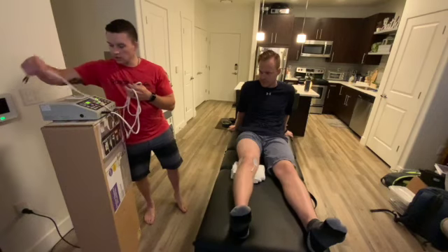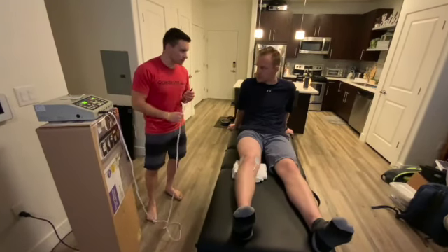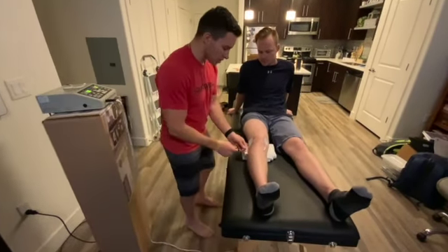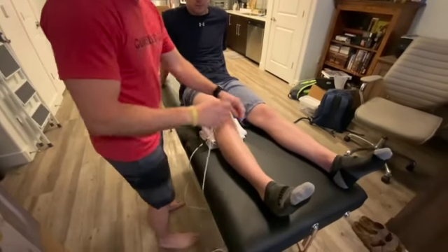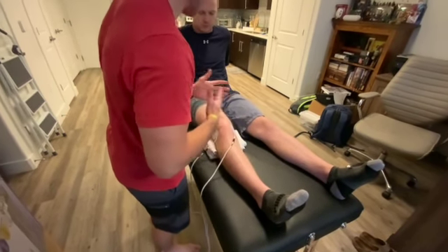Okay, so when I start it up, it'll be just like a little tingly sensation when you first start feeling it. It won't hurt or anything like that. As soon as you start feeling that, just let me know once I get this thing started. And like I said, we don't want any pain or anything. So what I want it to be is a comfortable tingle on there.